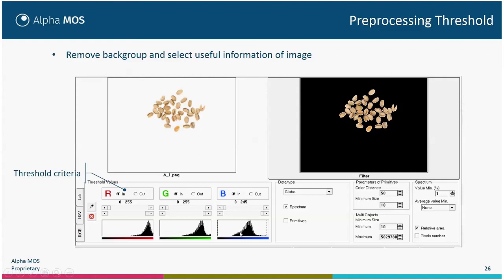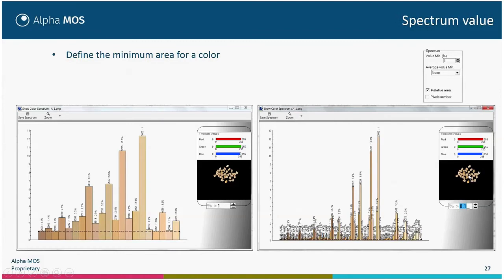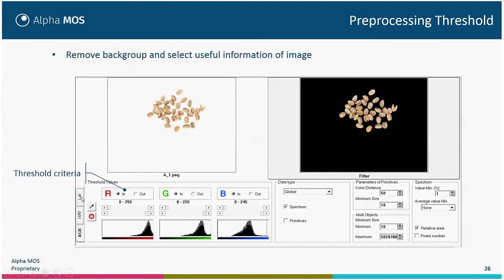The pre-processing threshold is very important to remove the background to get only the sample. You can adjust the removal of background color — most of the time it's blue, it can be green — but only a few pixels, because you should not remove any white that may appear on the sample. There are different color space possibilities: RGB, HSV, and LAB — we will see the difference between these color coordinates later.